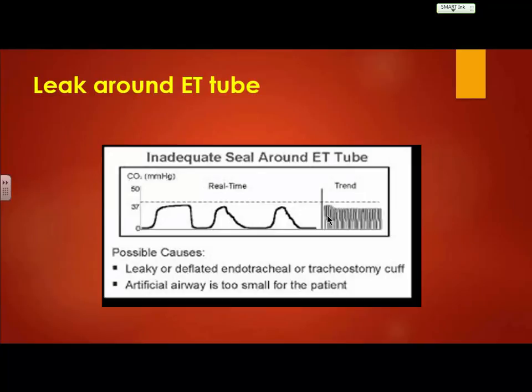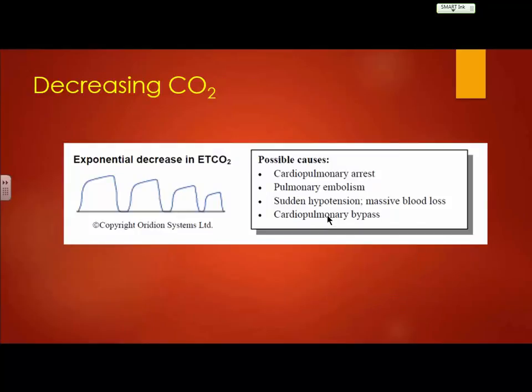So, again, with equipment malfunction and stuff, if you're trucking along and nothing's really changed for your patient, and you start seeing these really weird waveforms, of course, check your patient first, but most likely you've got an equipment malfunction. Those sampling tubes are designed to withstand a little while, but they're not designed to withstand prolonged monitoring. I mean, we had to change ours in the ICU like every 6 hours, because they get clogged very easily. Samplings don't work for a long time. All right.